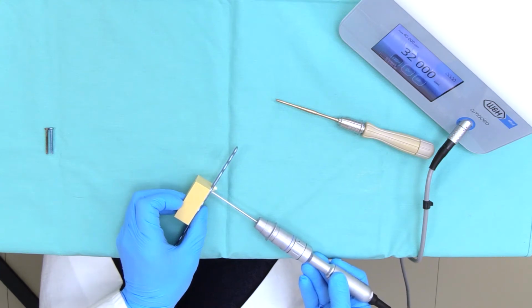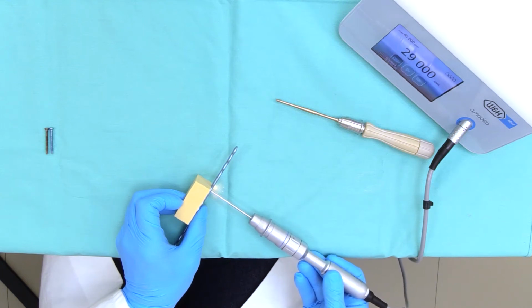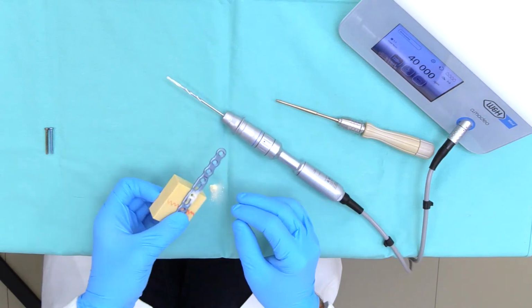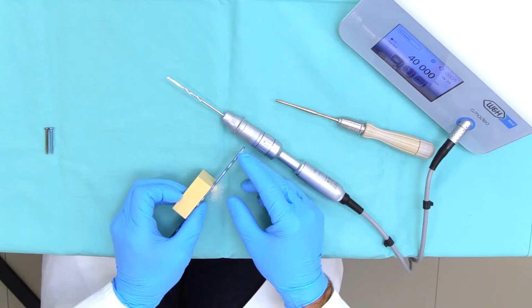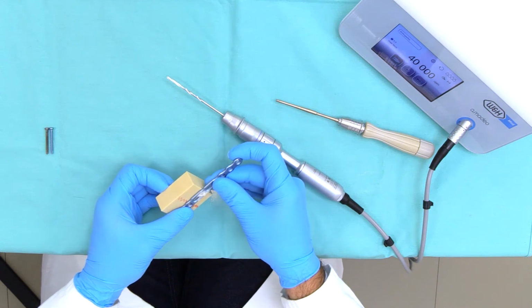The surgeon feels it with the screwdriver or the driller. After we have drilled the hole, the right length is measured and the appropriate screw is attached.